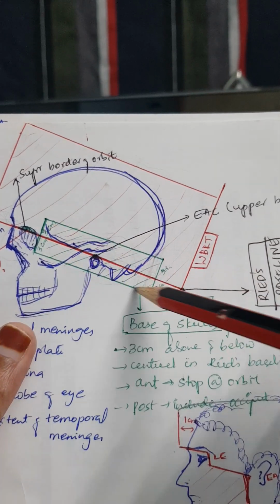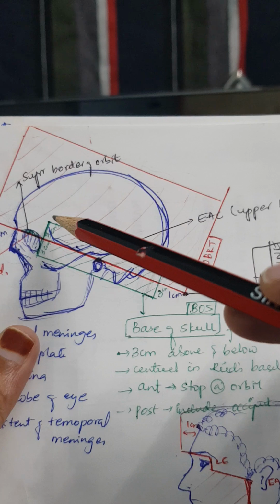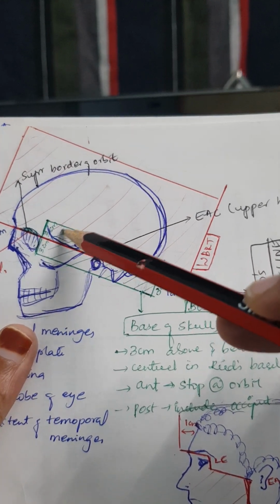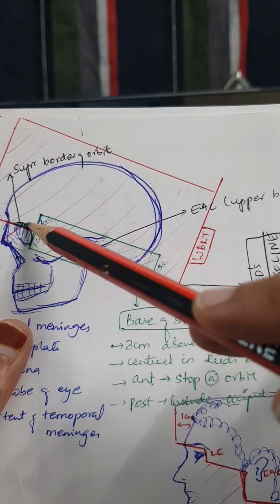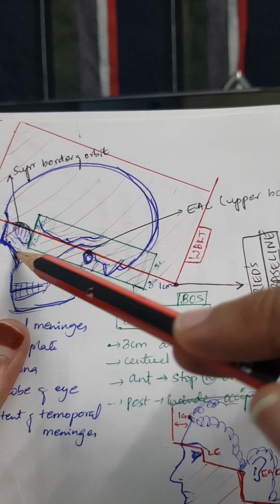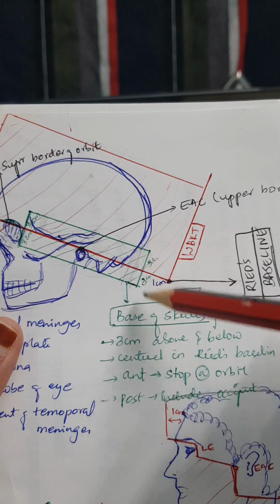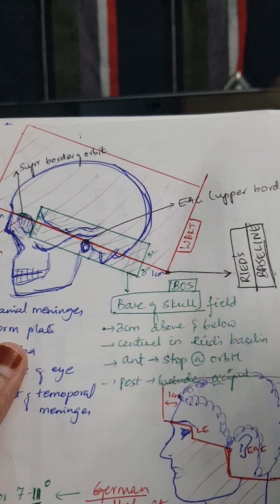So here this is the base of skull. You will also include the base of the skull, 3 centimeters below and 3 centimeters above the Reed's baseline. So you will stop at the posterior end of the orbit, or you can also use an eye shield over here. Posteriorly, you will include the occiput and 1 centimeter of fall off.